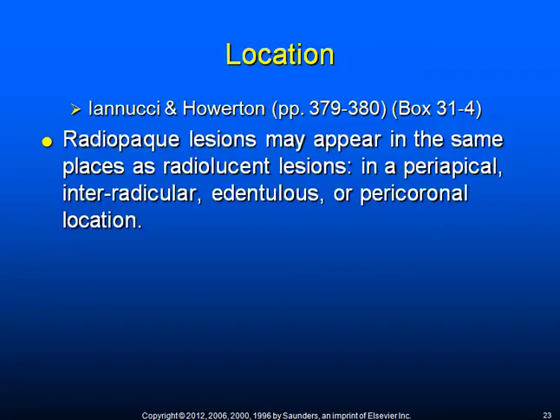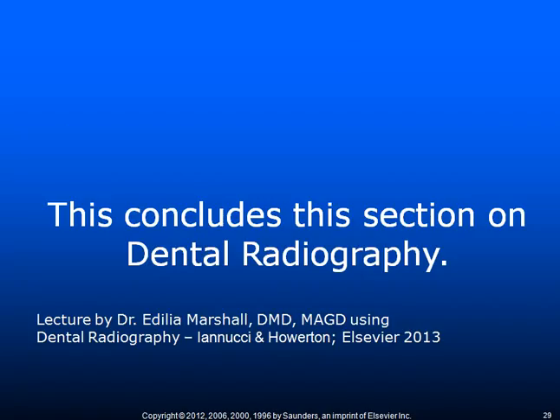The location of a lesion is important for communication and documentation. Radiopaque lesions may appear in the same places as radiolucent lesions. In that sense, the location would be described the same way using the same terminology. This concludes this section on descriptive radiographic terminology.